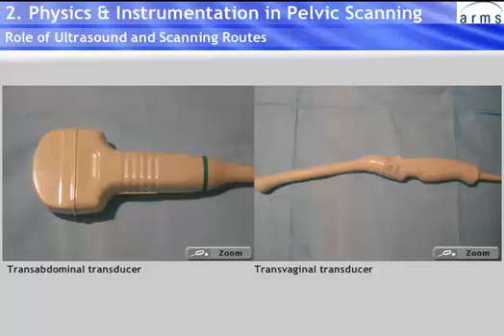Sonography is a tool that can provide valuable data regarding the location, age, and condition of the pregnancy when used properly by adequately trained personnel. Understanding the physics and instrumentation of ultrasound is essential to make the best use of this tool.